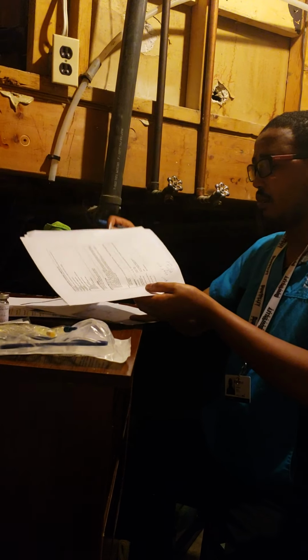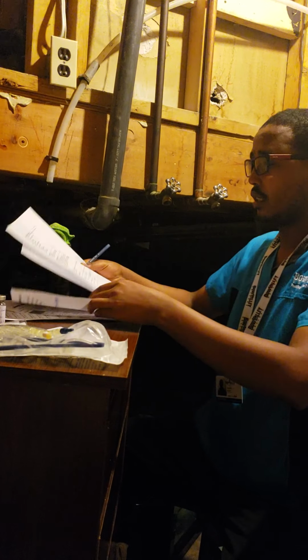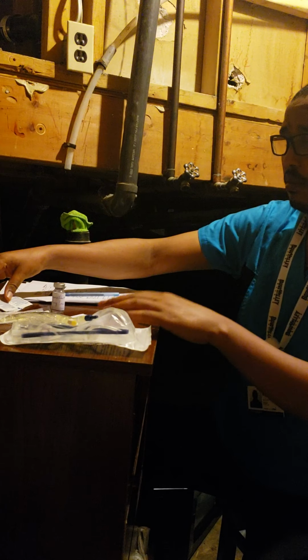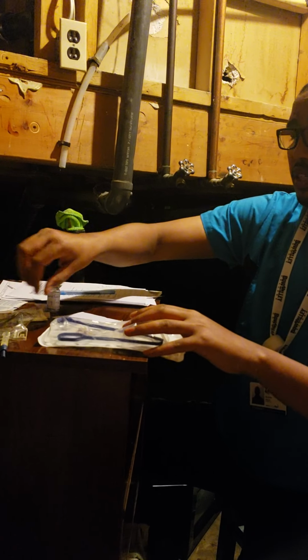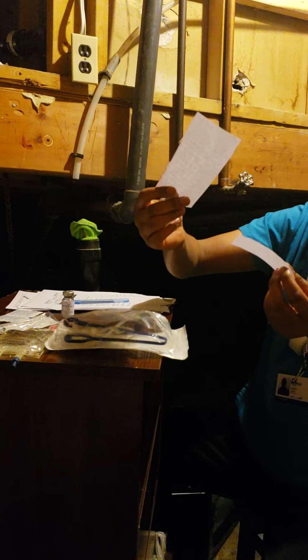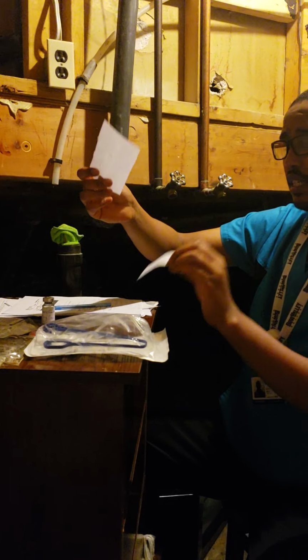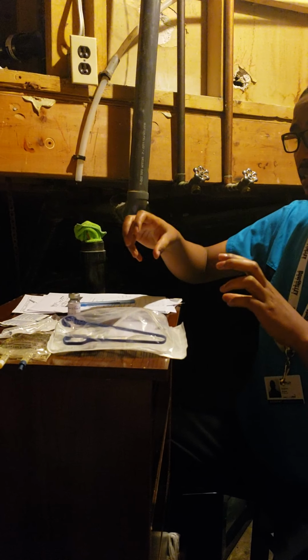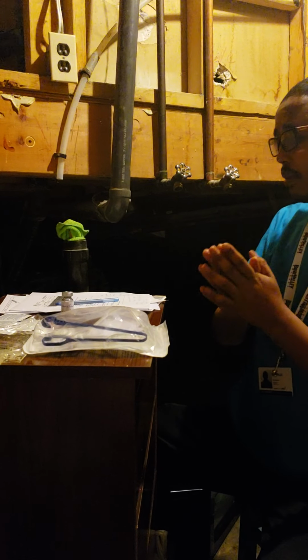And the next step is I have to collect my supplies. So my supplies are: this is my medication, this is my alcohol swab, this is my mini bag solution, this is my secondary IV line, and this is my syringe and needles, and this is going to be my labeling for medication and secondary IV tube, and this is my sharps container. Most of my supplies are already used ones, so beware of that.